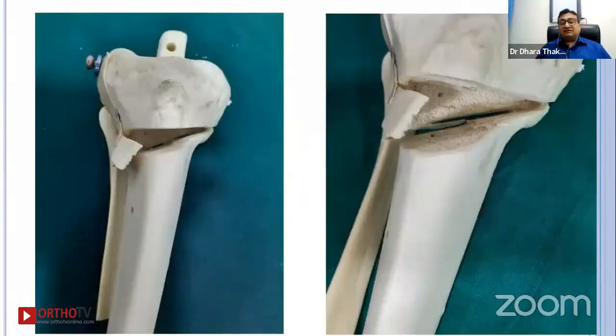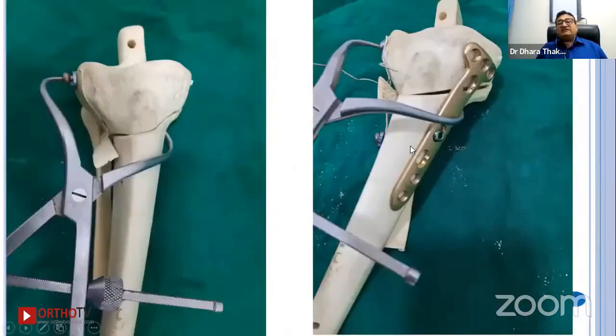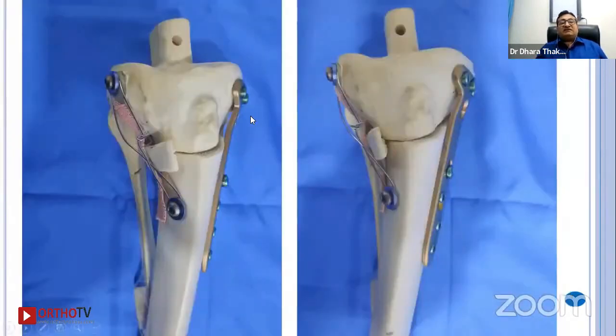So if we see on a model, then we can see here that the wedge is removed like this. This cortex is kept intact with this soft tissue attachment, and only the distal posterior cortex is being cut, not the proximal posterior cortex, and this is how it has been closed. And here during surgery, we hold like this, one point we keep here, and the second point of the patella holding forceps we keep like this, and after that we put a plate and fix it with the screw. And this is the final picture after fixation.